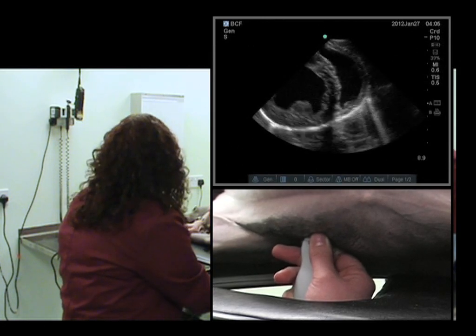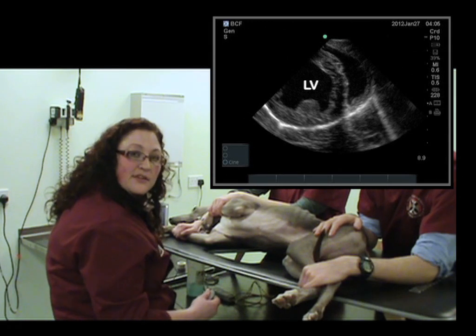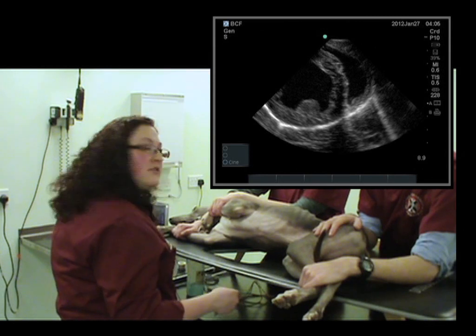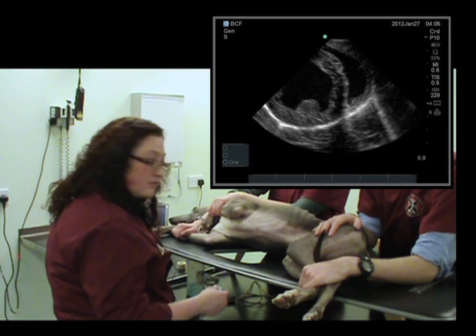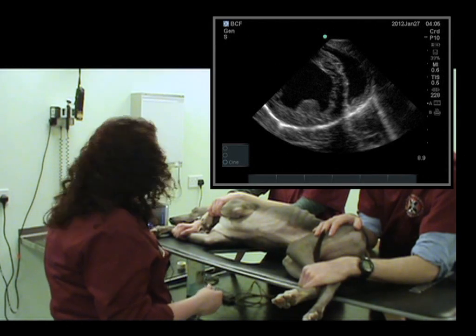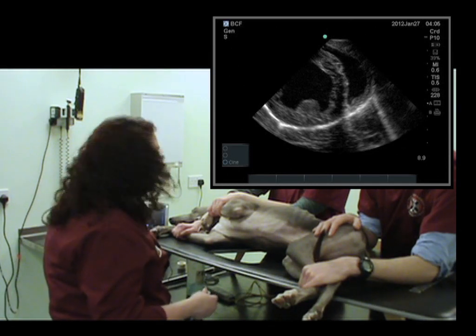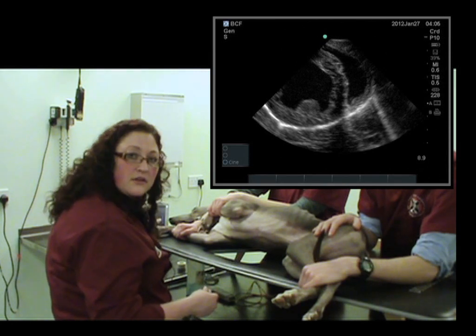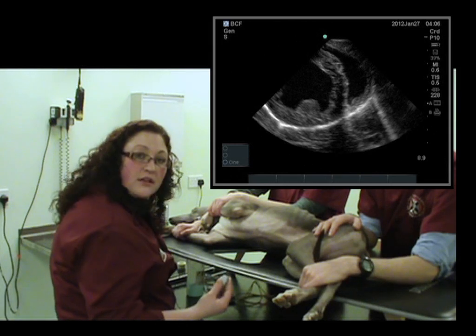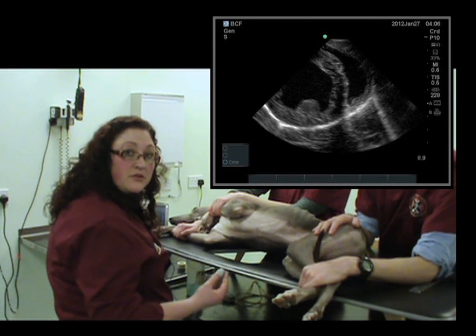As you can see, the left ventricle is actually half hanging off the left side of the screen. This can happen based on the orientation of the dog and the orientation of your probe. This is not necessarily a problem, because the most important thing is to get a really symmetrical view of the mitral valves, the papillary muscles, and the left ventricle — as symmetrical as possible with a true mushroom shape. If that means the ventricle doesn't fully fill the screen, that's okay, as long as it is symmetrical. What we can do is potentially move a rib space cranially or caudally to get a slightly better view, though this is not always possible.